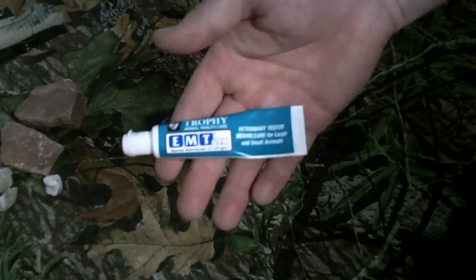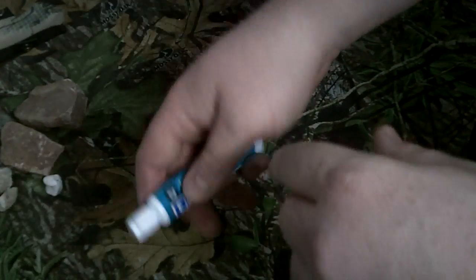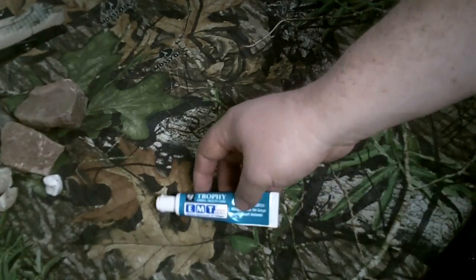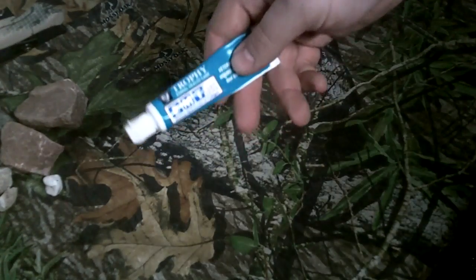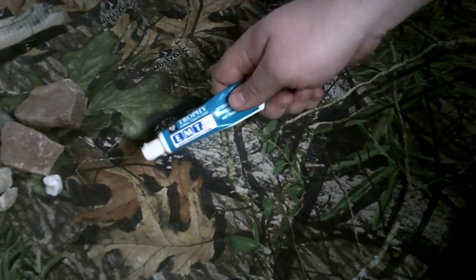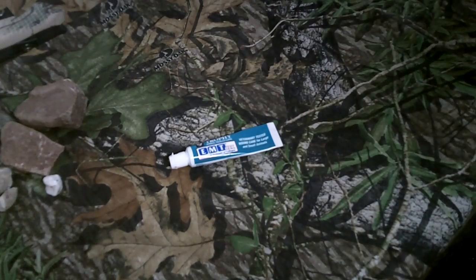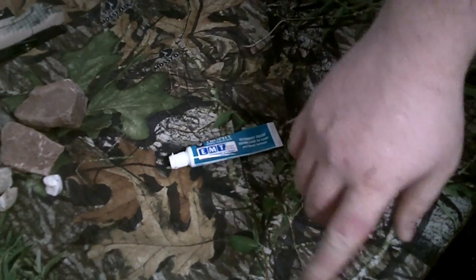And I think that was kind of originally, Dave had just put it right over his arm that he had scratched with his knife, and it started bleeding a little bit, and he just put it right over that. Well, for that tiny little scratch, maybe, but if you cut yourself decent enough, this won't cure and harden quick enough to keep the wound from bleeding itself out. And so what I found on my leg is, when I put it on there, one, it was sort of difficult to get on there.